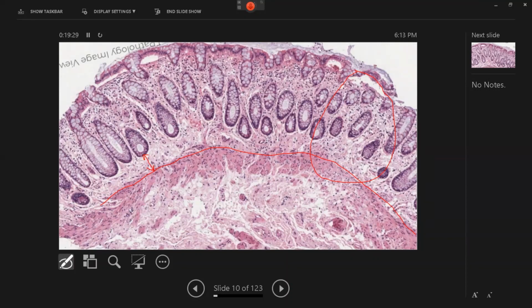But overall, what does that tell you? Despite the fact that you don't see a lot of architectural distortion apart from the crypt atrophy, this is enough to call it quiescent colitis if you have a patient known to have ulcerative colitis or Crohn's disease before.